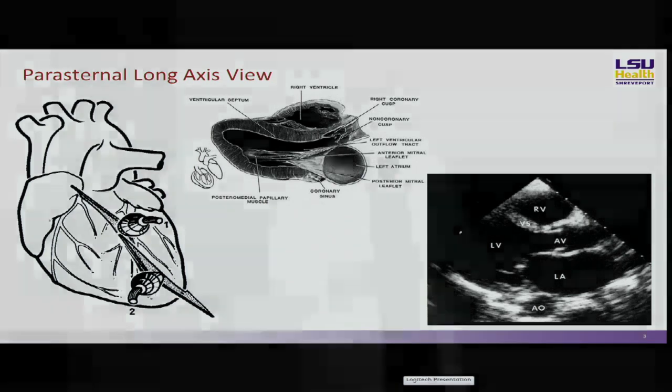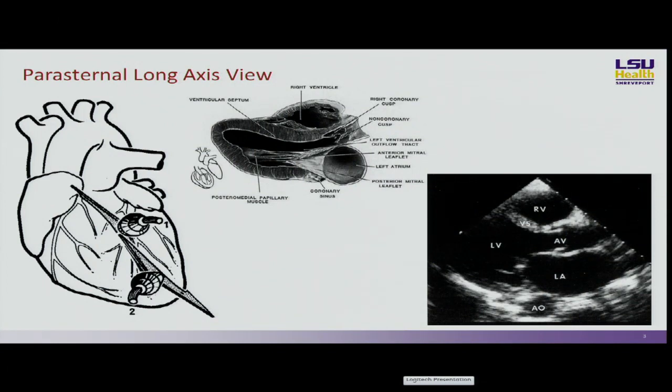So we're going to spend less time at the bedside. We're going to get in, get our questions answered, and get out. And we're going to go back in repeatedly to assess our response to therapy. If you try to get an echo from cardiology less than 6 months from the last one, you're going to get some pushback. So this is a skill that has to be taught at the bedside, and it is now officially incorporated into critical care training programs. It's always been in our program ever since the inception some 25, 30 years ago, but it's now required by the ACGME for critical care training.